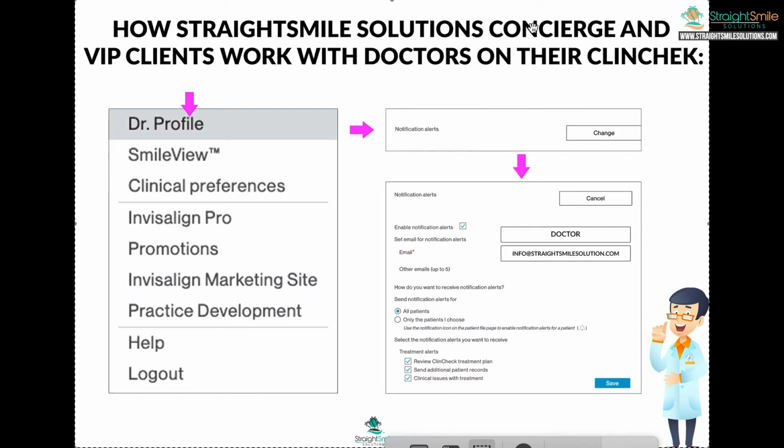And I'm telling you, we're going to flip these things around so fast, you're not going to know what hit you. These things are going to get done in a matter of days, not weeks. They won't pile up. If we have a question, we're going to ask you. So keep your eye out. If we have a concern, we're going to ask you. The reason why we have to do this with VIP and concierge is sometimes we got to talk about stuff. We got to talk about options. We got to talk about risk, benefits, and alternatives. Sometimes we'll have a couple different versions we can work up, and you're going to want to show the patient.